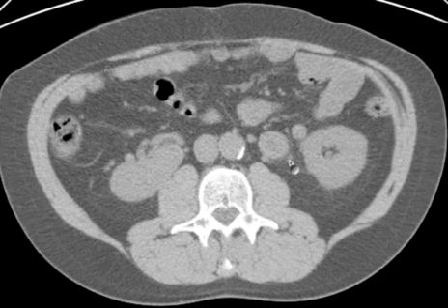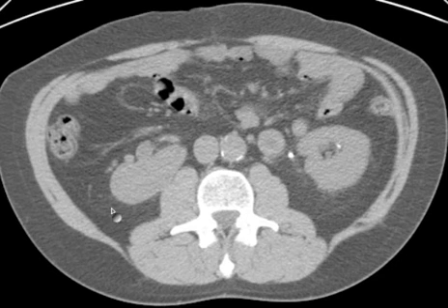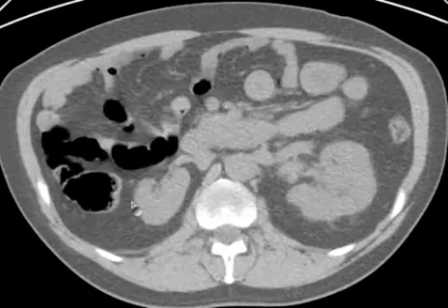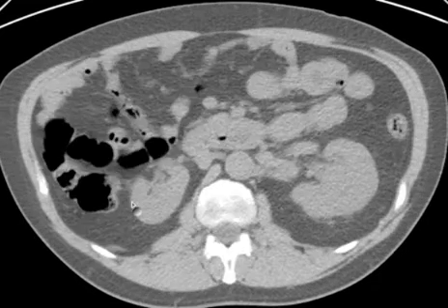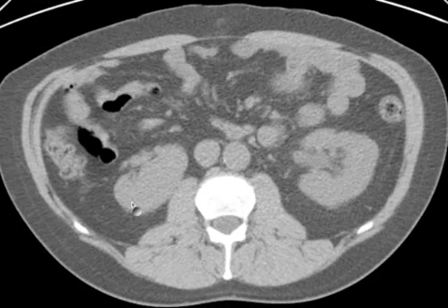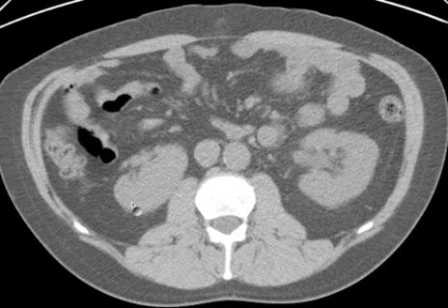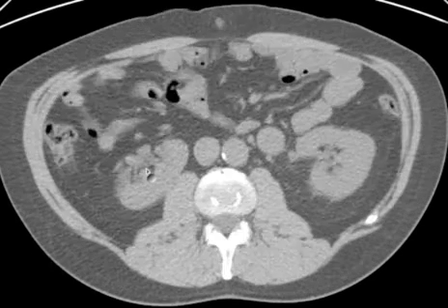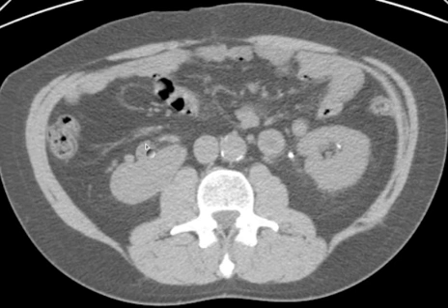The interesting finding here, however, is this kidney. What's wrong with that? That's malrotation. Malrotation — because the kidneys during embryology ascend from the pelvis and ordinarily undergo a rotation such that the hilum and renal pelvis are directed medially. In this case, that rotational component of the motion did not occur, so the pelvis is pointed anteriorly.